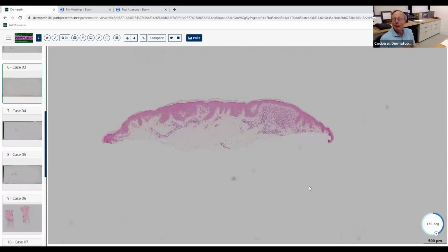And we know there are 5 patterns of granulomatous inflammation also, right? Yes. I won't make you recite those, but make sure you know them for the board examination because they're useful. They help you when you're making a diagnosis. So which type are we looking at right here? Sarcoidal? Yes, maybe? Yeah, I would agree. It's sarcoidal. And why sarcoidal?